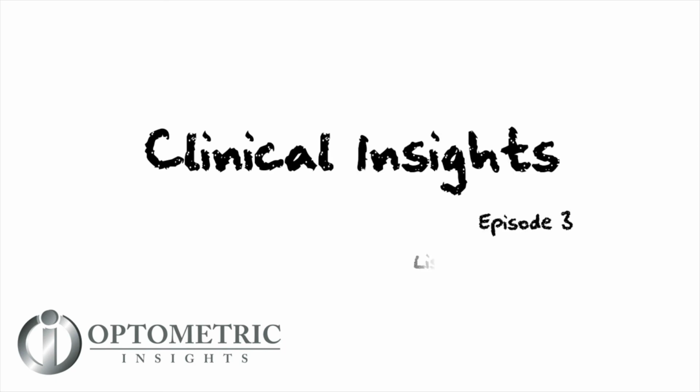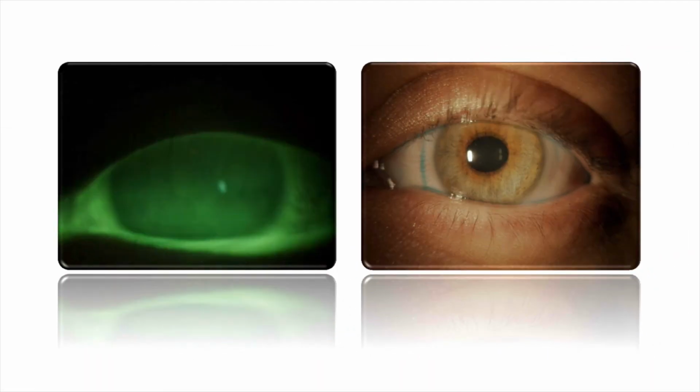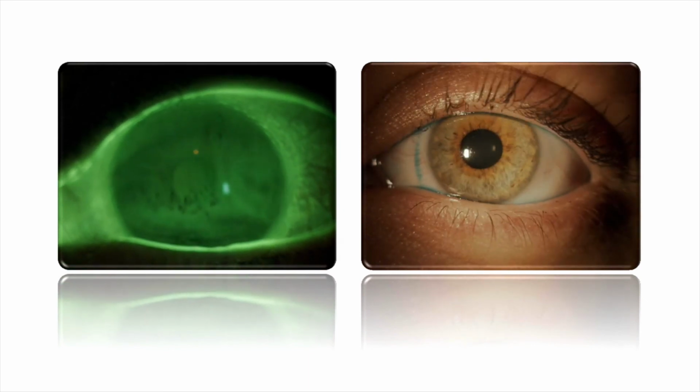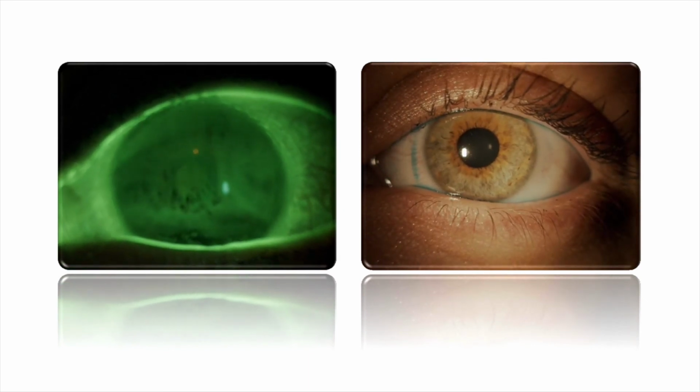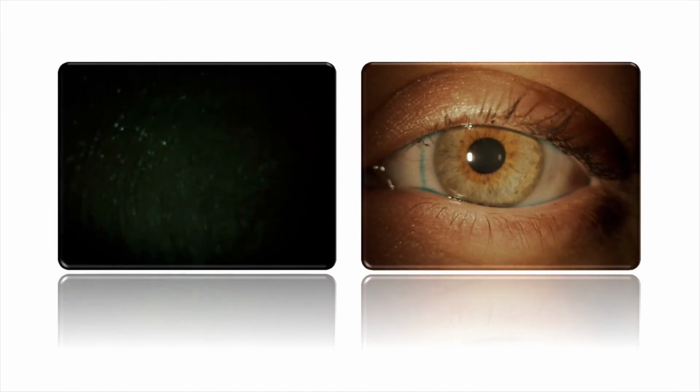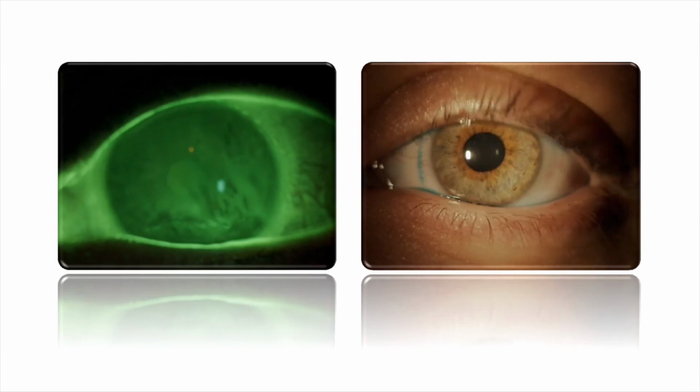Vital dyes are a critical part of our optometric examination. For most of us, we tend to turn to fluorescein on a pretty regular basis, but over the last couple of years, we've seen that Lissamine green and rose bengal have seemed to kind of fade away from most practices' daily examinations. Lissamine green is typically supplied at a 1% concentration.